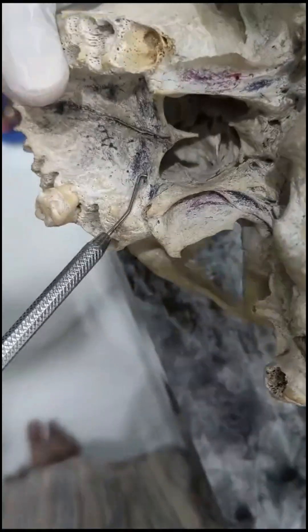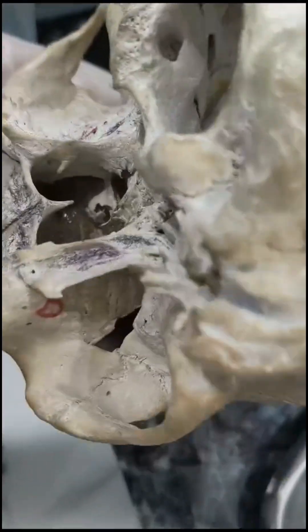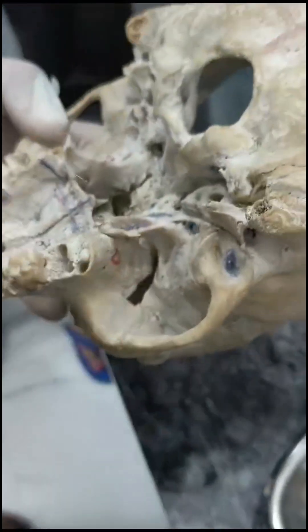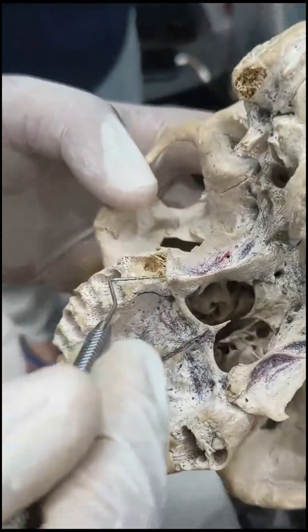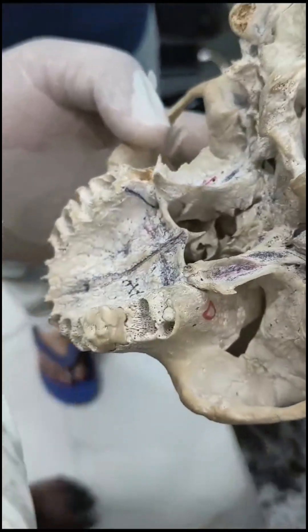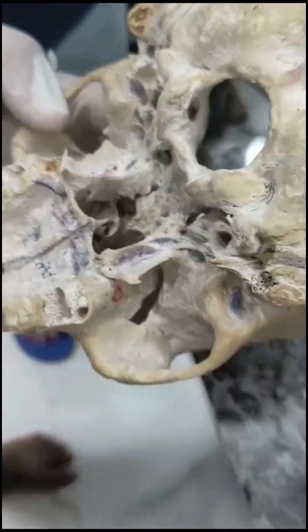We need to be very careful. Let's move ahead and proceed with drilling. Since this is a very dry, old, dried human skull, there are chances that due to torquing forces there might be more crumbling or fracture of the plates — but we are mentally prepared for that. That is how the learning goes.